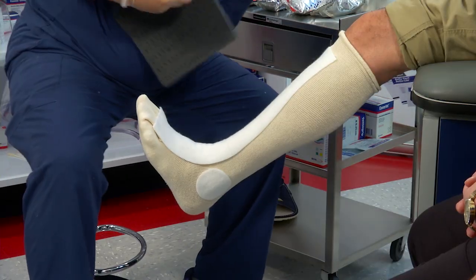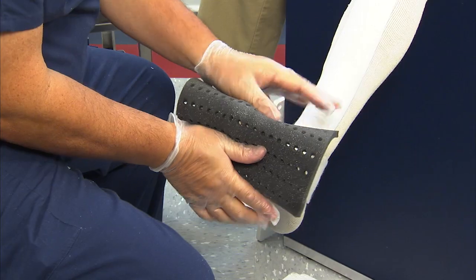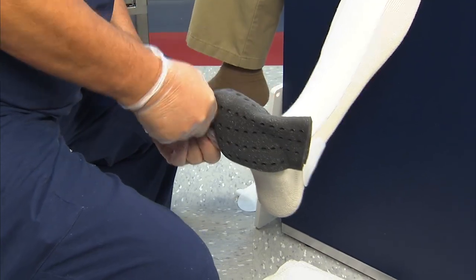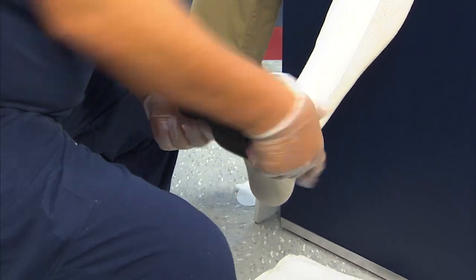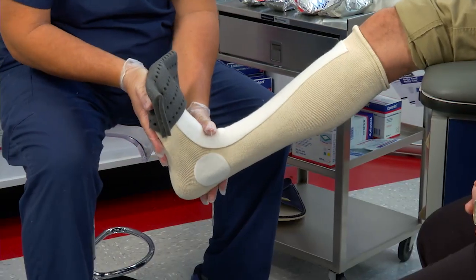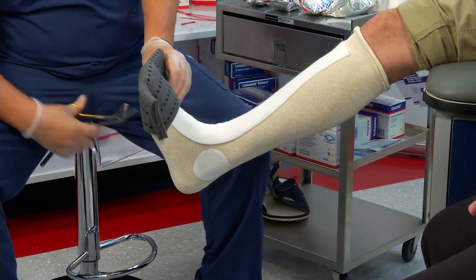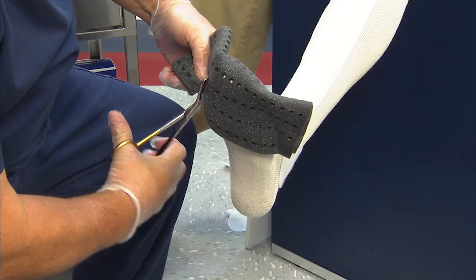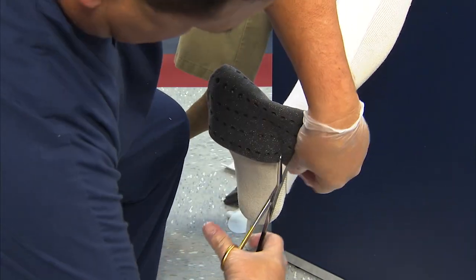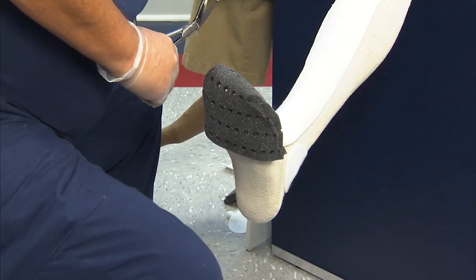Then I'm going to take this perforated black foam and place it right over the toes to create a toe box. I'm going to pinch the sides together — you'll see that it'll make a nice little template for you to cut from, keeping them at 90 degrees. Then take your scissors and cut away from the patient, because if he has any splayed toe you may nick it. You want to make it nice and contoured to the skin.